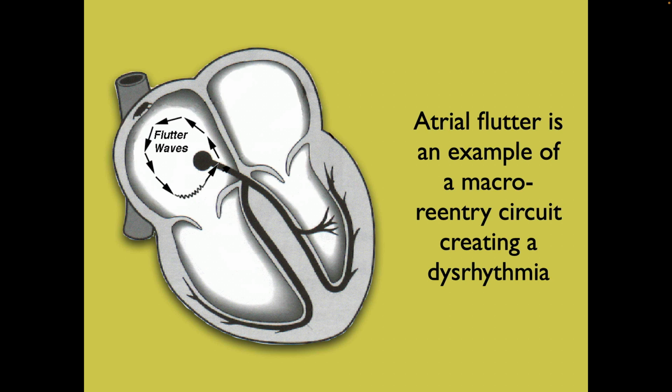You don't have to know those numbers. I'm only pointing it out to say that typically atrial flutter is regular because it goes round and round in a regular fashion and it will depolarize every second, or maybe every third, or maybe every fourth. And so a flutter doesn't have to be regular, but typically it's regular.